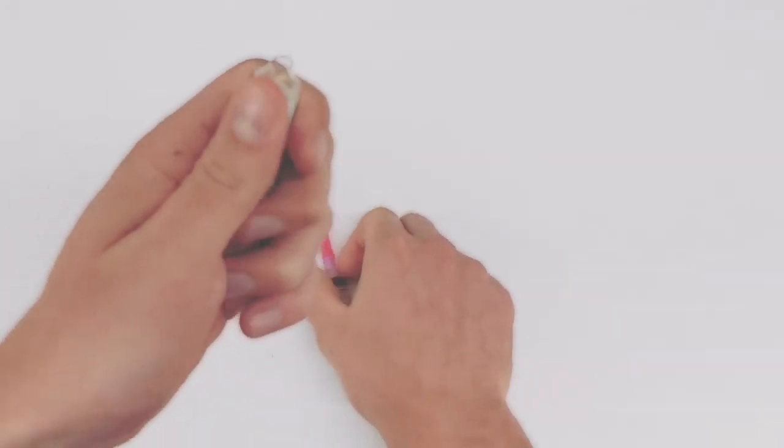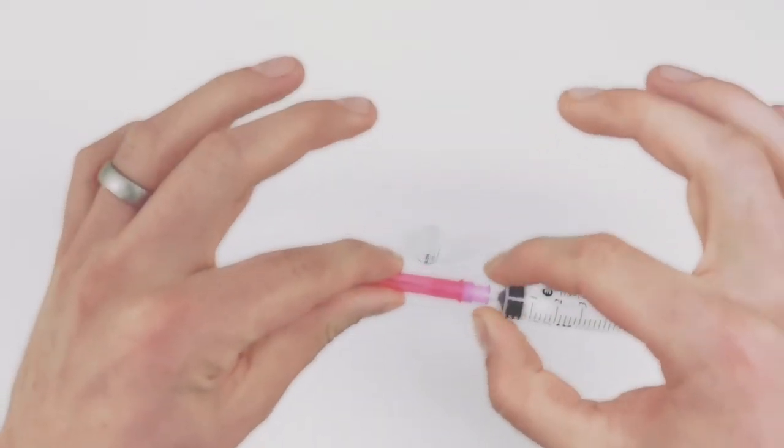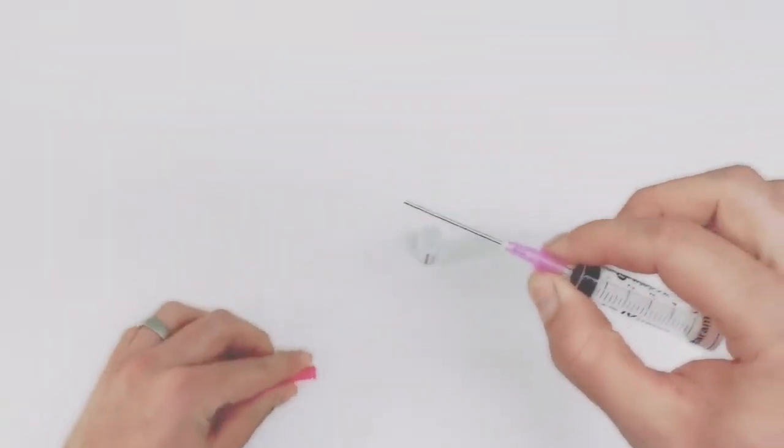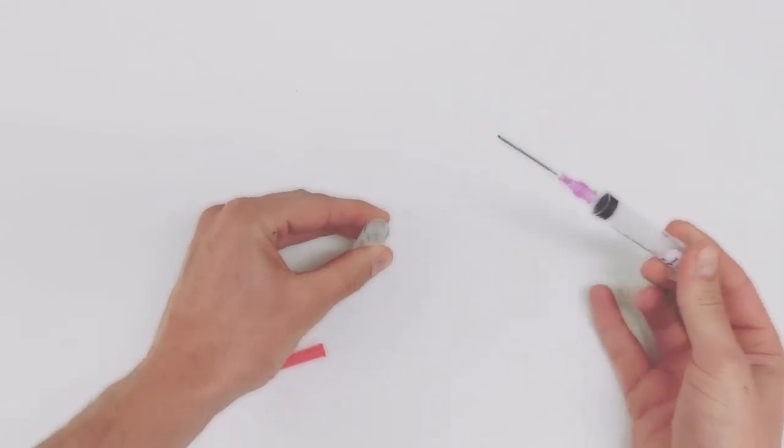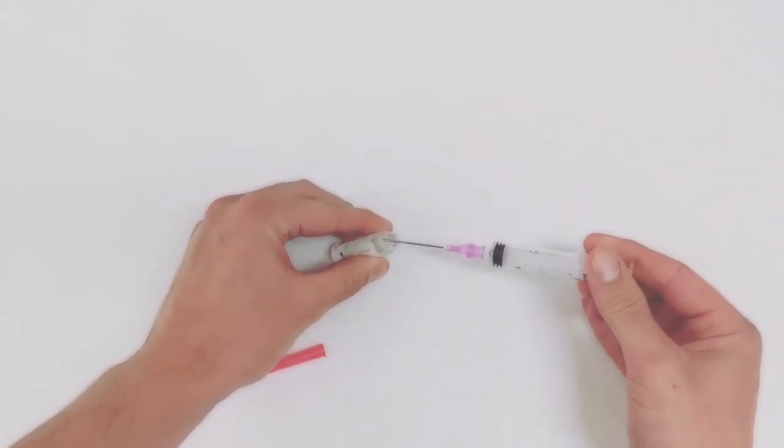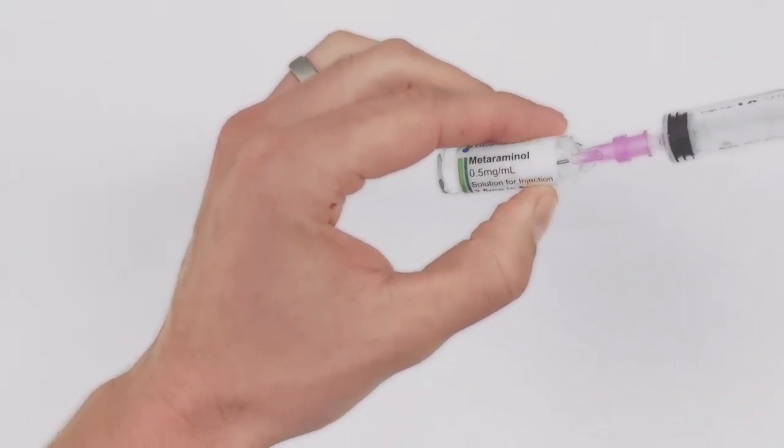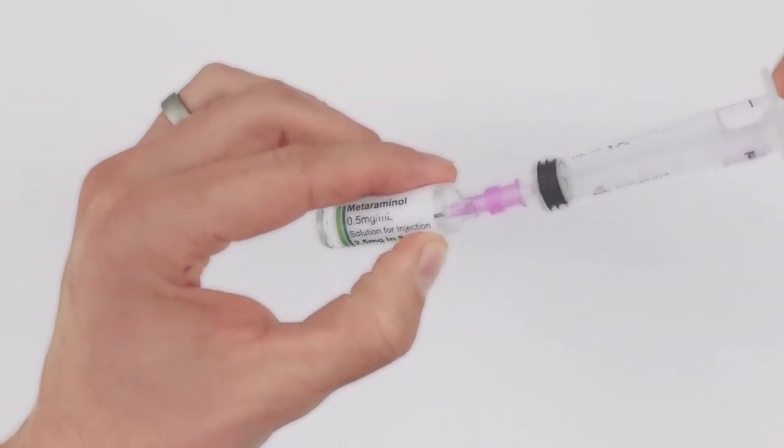Get rid of this bit and then I put my vial down. I hold the hub here, pull the top off the needle. Now I have shaky hands, so I often will stabilize my hands to put the needle into the vial. I put it right down to the bottom and then I draw back.